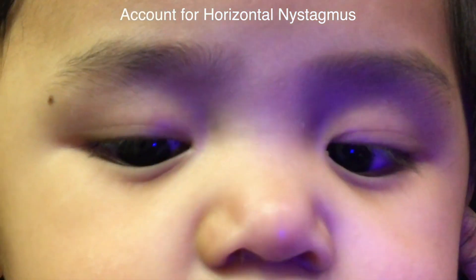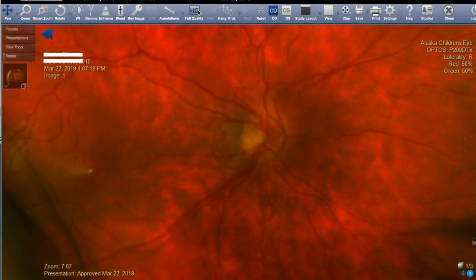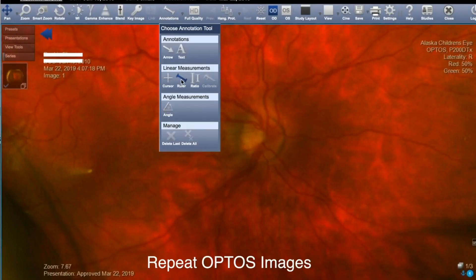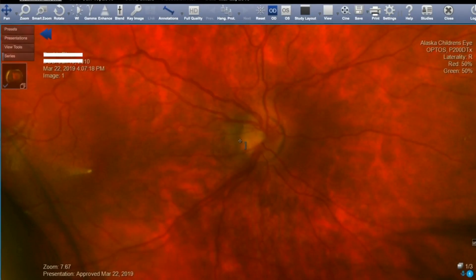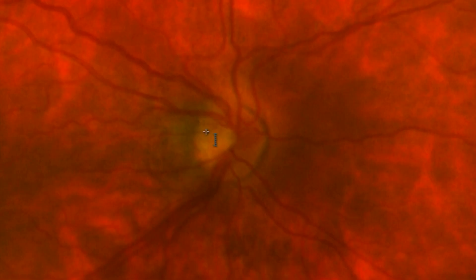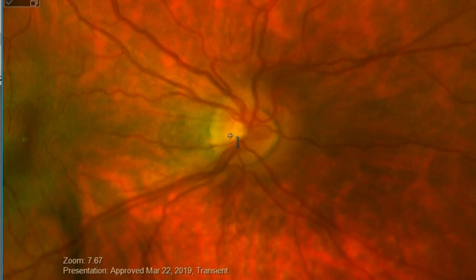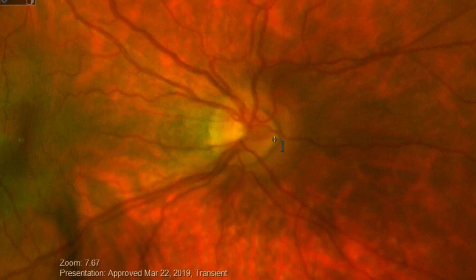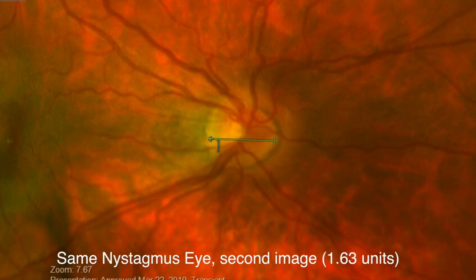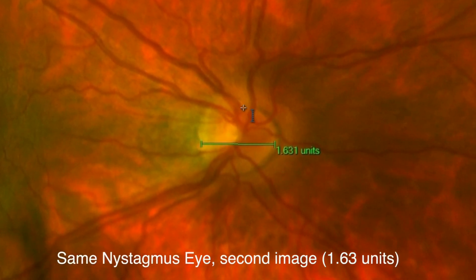Horizontal nystagmus complicates the measurements of the optic nerve dimensions. Repeat measures in cooperative patients allow repeat measurement of the horizontal and vertical dimensions of the optic nerve in the presence of nystagmus. If the nystagmus is traveling with the scanning laser, the optic nerve horizontally may appear very wide.